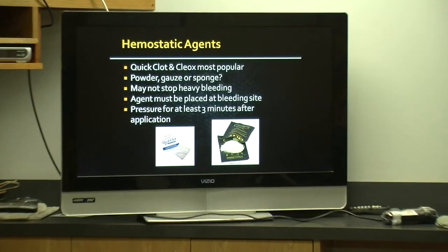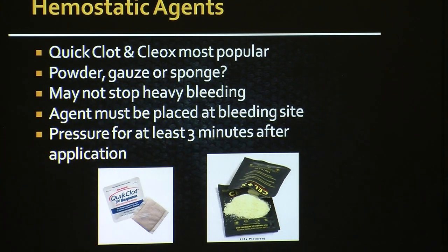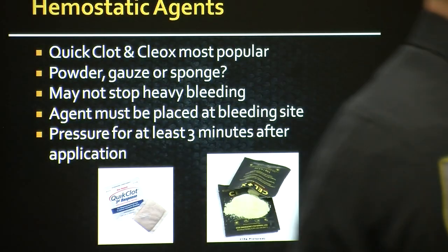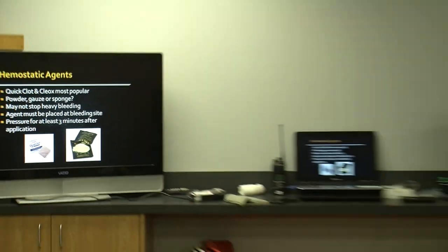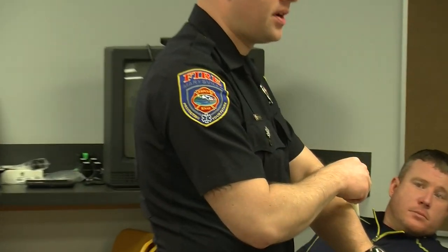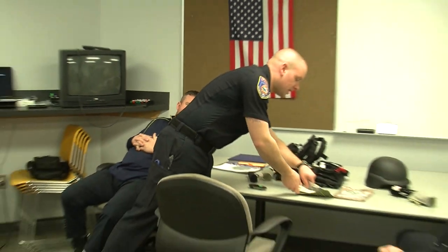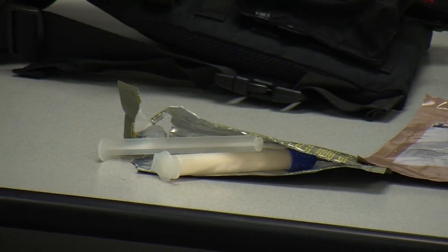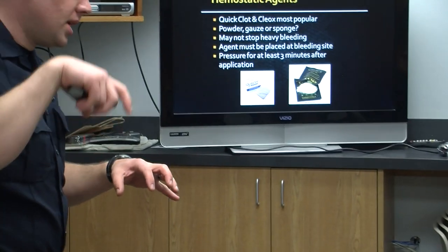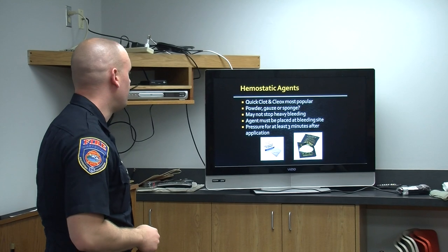The hemostatic agents, you guys have QuikClot in some vests or cars, it's kind of sporadic throughout, but we're working on getting this Celox. This is the applicator version they sell that goes into a penetrating wound so I can inject it in there. What I like more than this is just the bag with the powder in it because it can be used in so many different areas, especially for that junctional hemorrhaging. You've got a big open wound, dump it in there, put pressure on there, and be done with it. This stuff works very, very well.